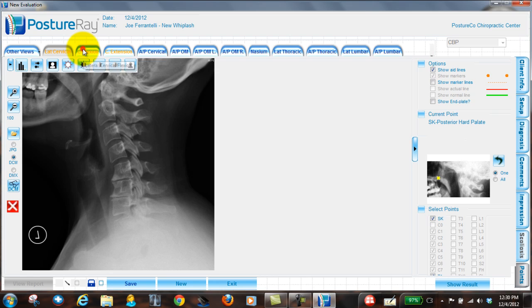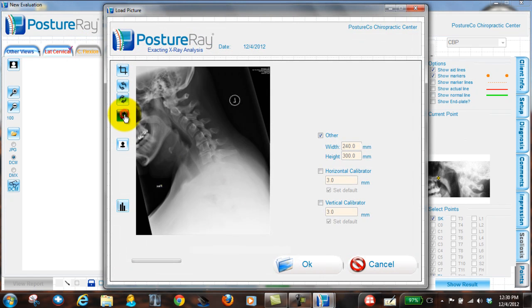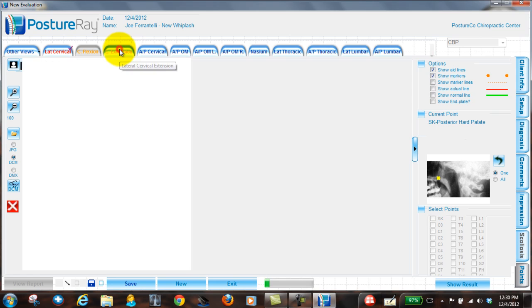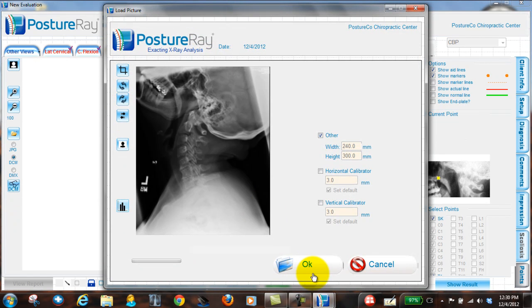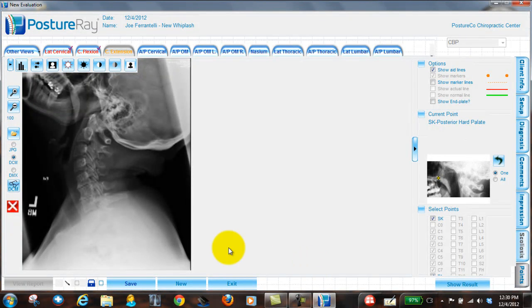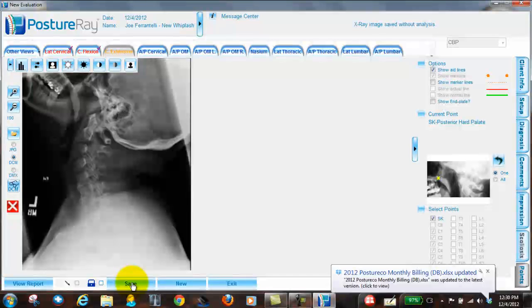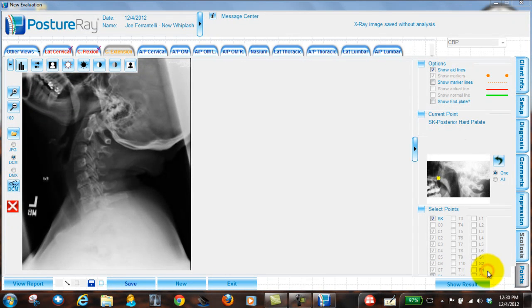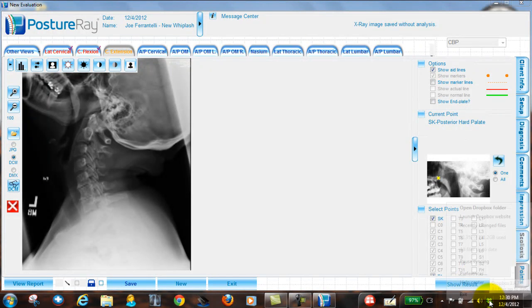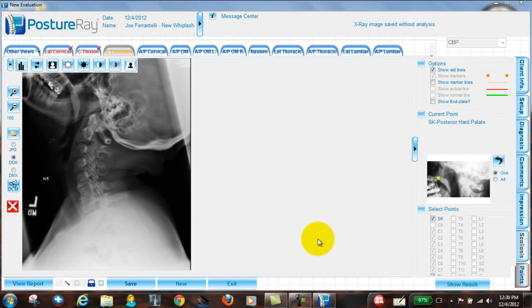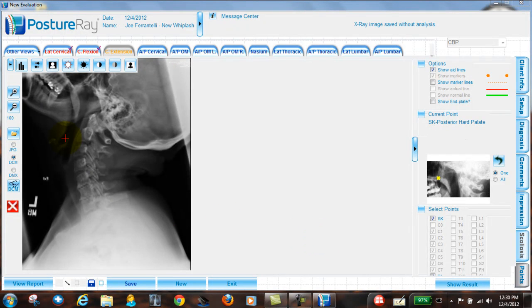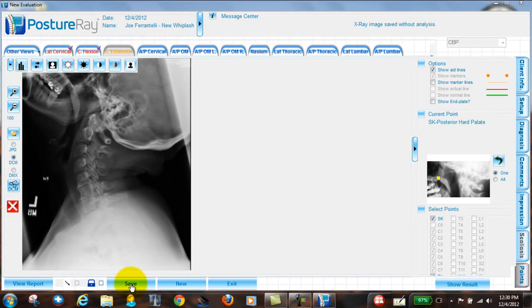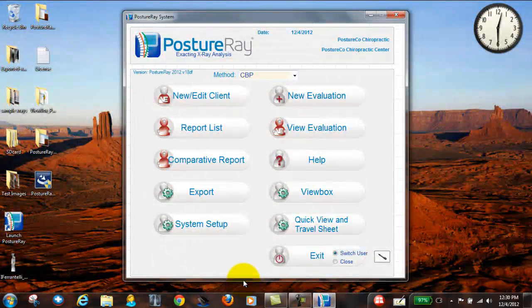We can crop this one down if we want to. I could go ahead and I could crop it like right here if I want to. Hit yes. And let's go ahead and do flexion. I'm just going to keep these the same size here just for time's sake. Notice I'm flipping the image. So at this point in time, we can hit save. We don't have to digitize at this point in time. So as you can see, we have this all ready to go. So what we can see is that we have flexion extension views for this patient. It just so happens to be me. It's a new whiplash injury. I just hit save. And then I'm all done.